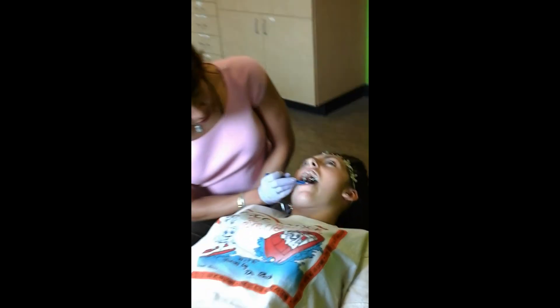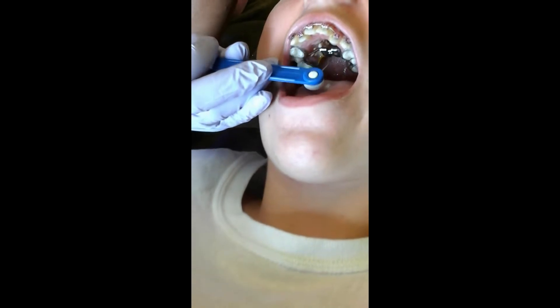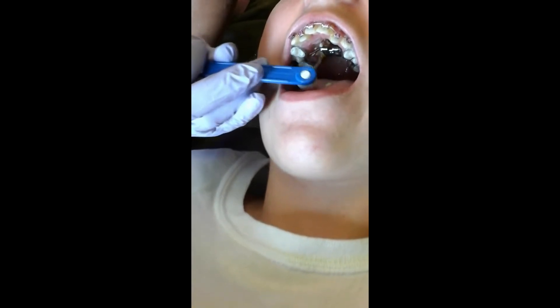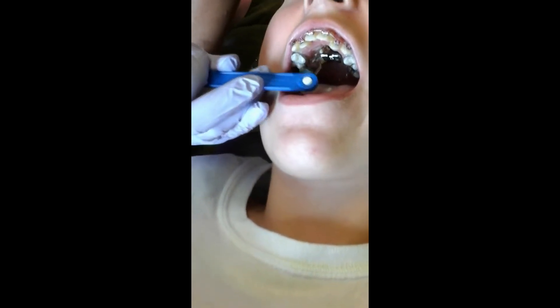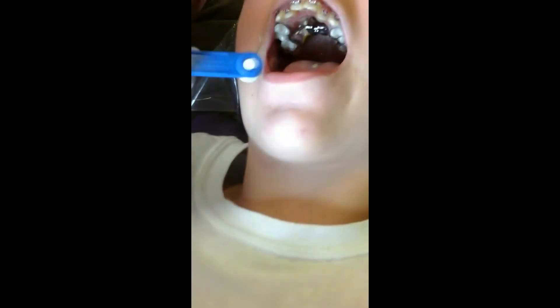Once you'll see, open here, there is a screw, and the way that it works is that every time we put this key into the hole and push it back towards her throat — because you always go in the direction of the arrows — this screw actually expands and pushes her teeth apart. So I'm going to show you how to do it.